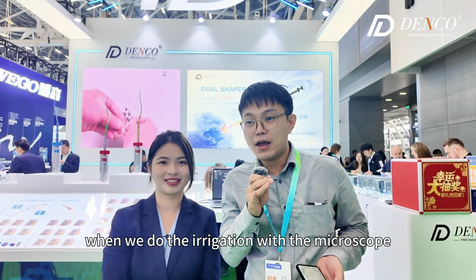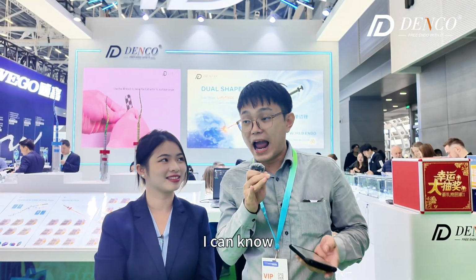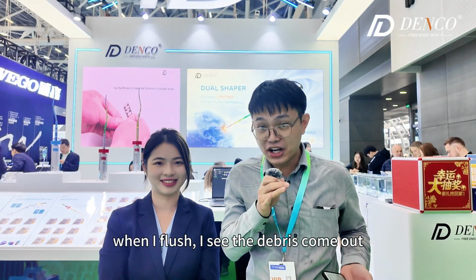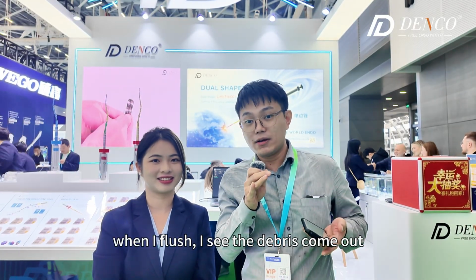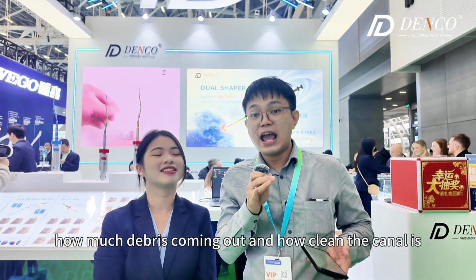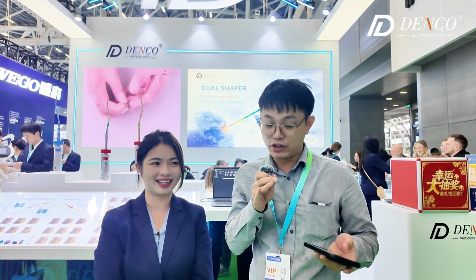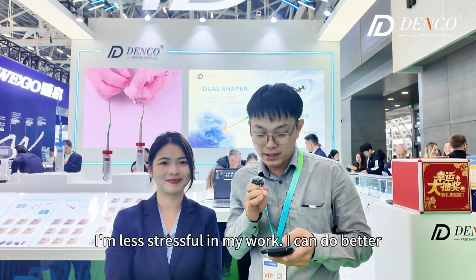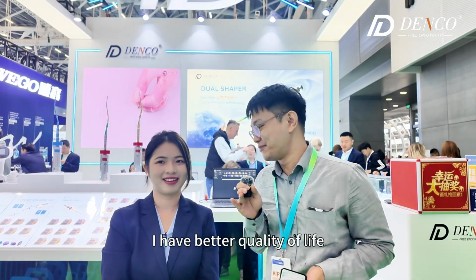Besides that, when we do the irrigation with the microscope, I can know, is the canal clean enough? When I flush, I see the debris come out, how much debris is coming out, and how clean the canal is. With the microscope, I'm less stressed in my work, I can do better, and of course, if we are less stressed, I have better quality of life.